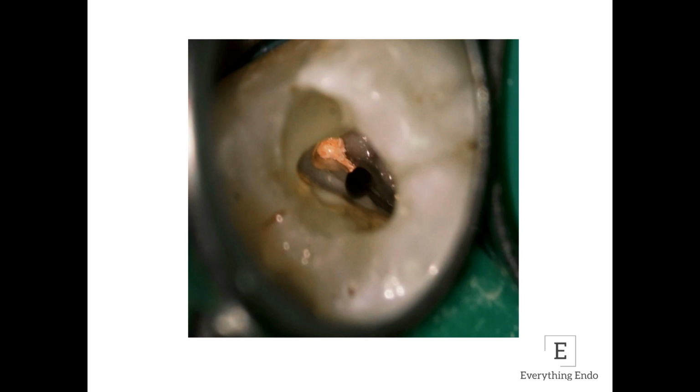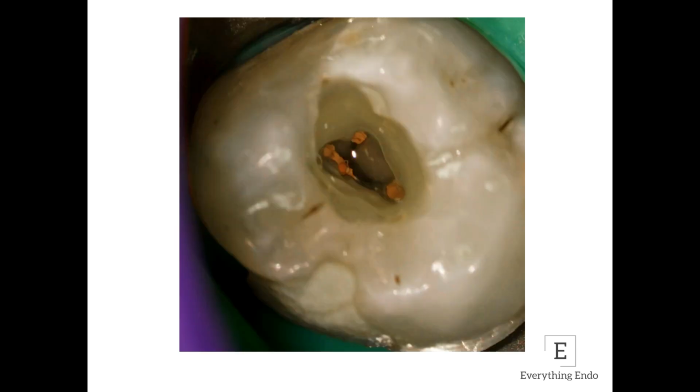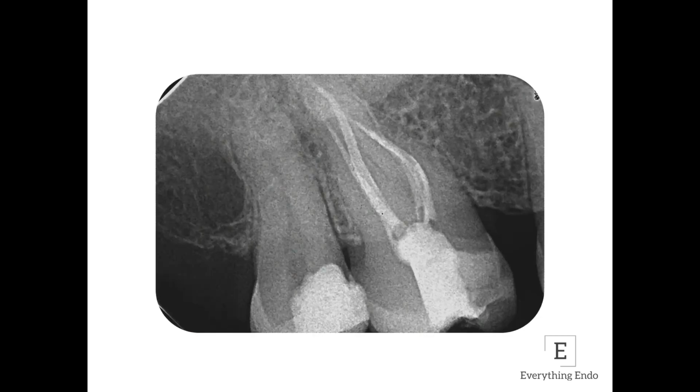And that's the MB2 canal shaped and ready for obturation. This is the final post-operative clinical picture with all the 4 canals very cleanly shaped and obturated. And that's the post-operative radiograph.